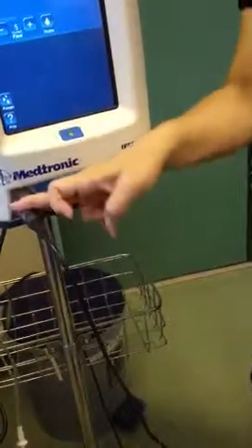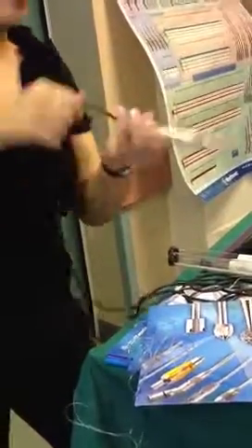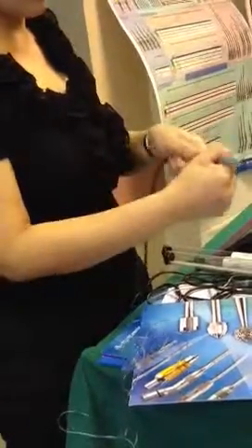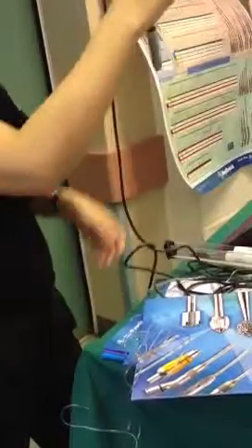And this connection end and the motor must never touch water. You cannot run it under the tap like that. This end must not touch water, and don't run water over it like that, because the motor is inbuilt here. You must face it down. Remember, you wipe it down or you face it down. Or you can cover it. You can run water with the attachment.